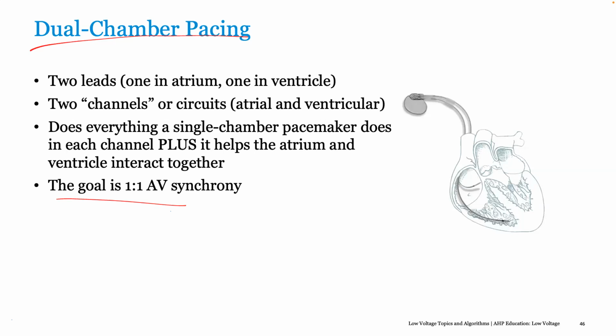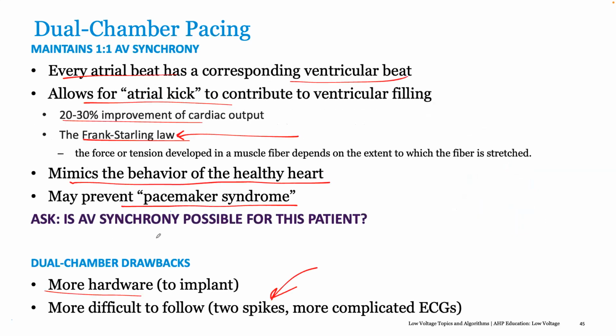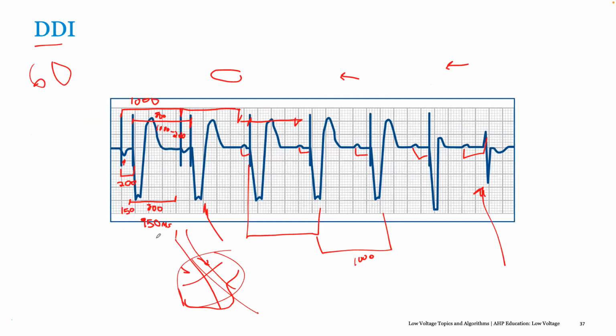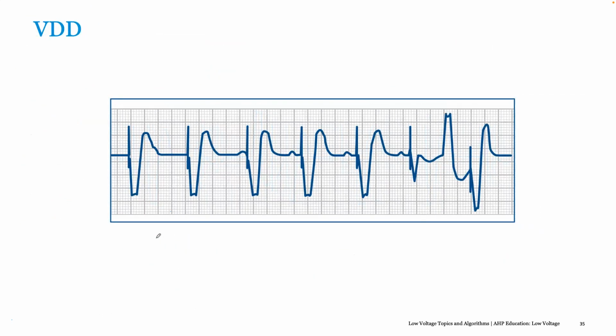A lot of the more modern devices these days have a thing called V-sense response, meaning that at the base rate of 60 or 70, if they're below that, then great, you'll be biventricular paced. But with AF, if you get a bit more fast conducted events, then by turning on ventricular sense response, it will trigger an LV pacing on top of the QRS, on top of the V sense. So it helps you up your BiV trigger a little bit.